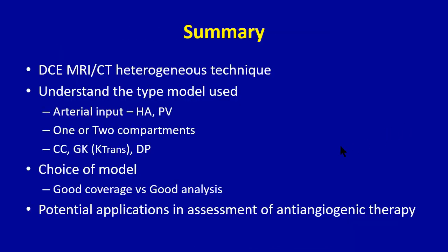And so I hope I've given you an understanding that DCE MRI is a heterogeneous technique. When you do use it, try to understand the model that's used, whether it is a one or two compartment, and whether it is a generalized kinetic model or a conventional compartment model. And the choice of model is a trade-off between coverage and good data analysis. And currently, the potential use is in the assessment of anti-angiogenic therapy.